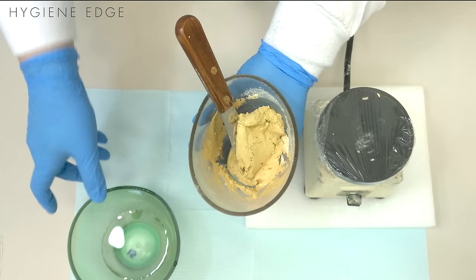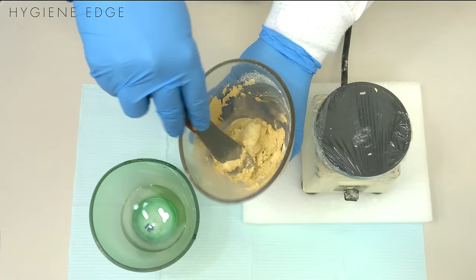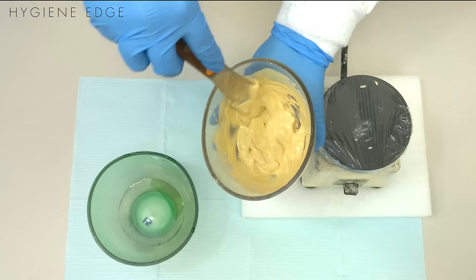You want to make sure you get all the bubbles out, so put lots of pressure against the side of the bowl. The consistency you want is kind of a thick, creamy peanut butter.